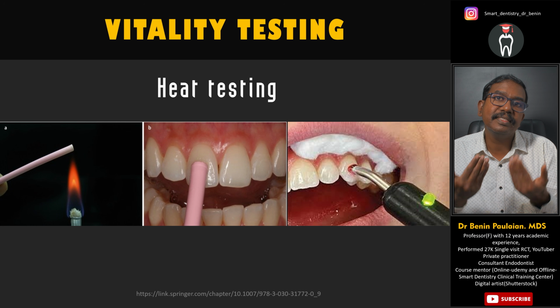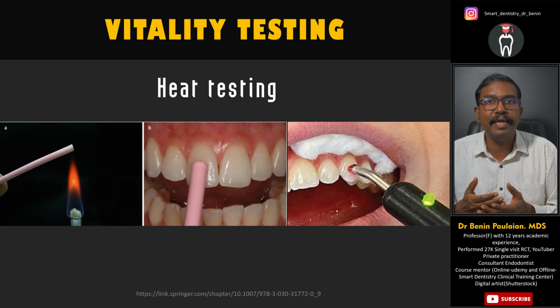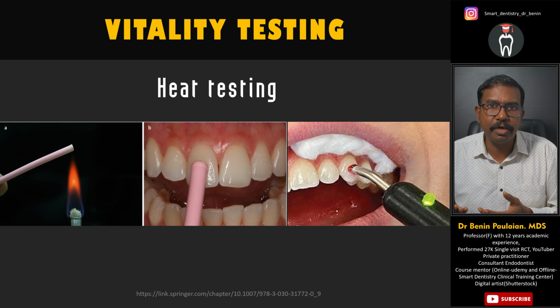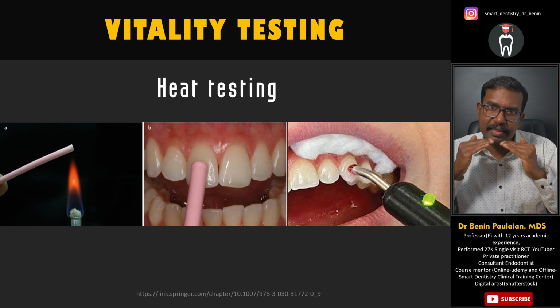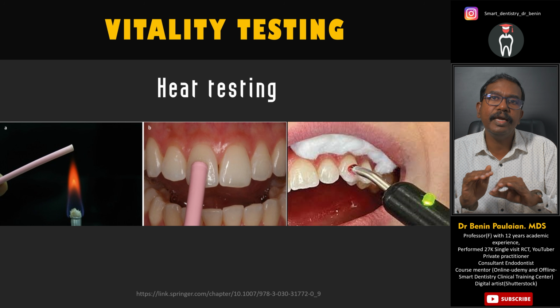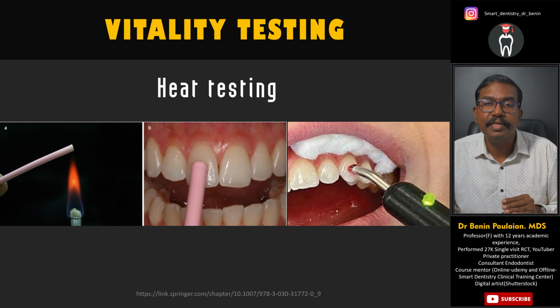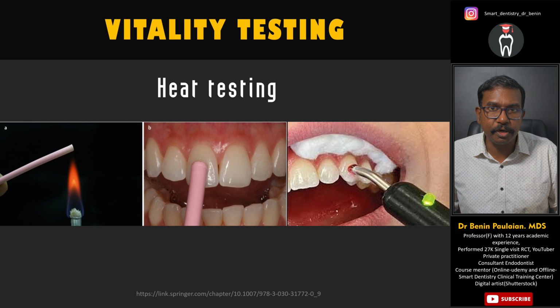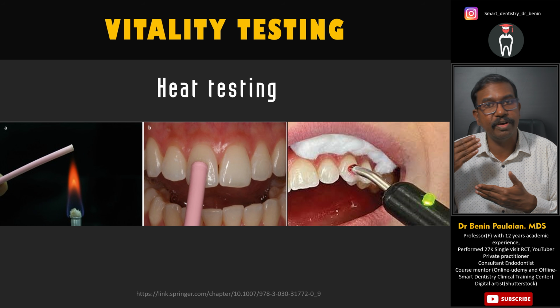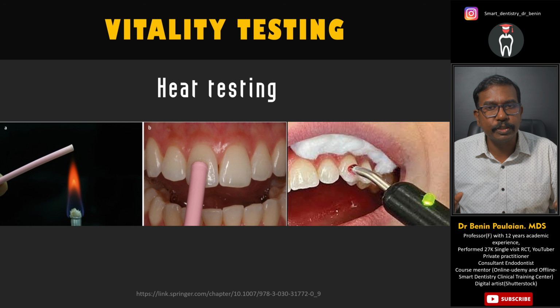If there is a sensation which is felt, for example, in 1 second, we would say that it is an early response. If it is felt in 3 seconds as in the normal tooth, then we can say that it is a normal response, or it could be felt in 5 seconds, and we can call it a delayed response, or if there is no response at all, even after applying for a prolonged time duration, we could call it a no response.